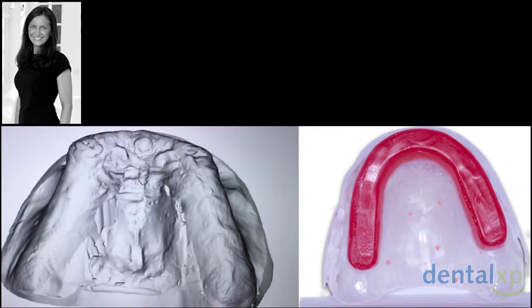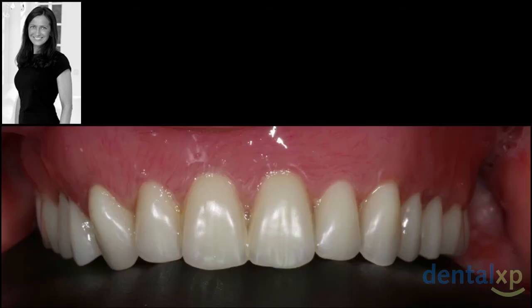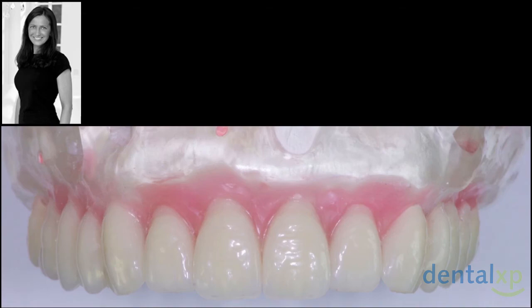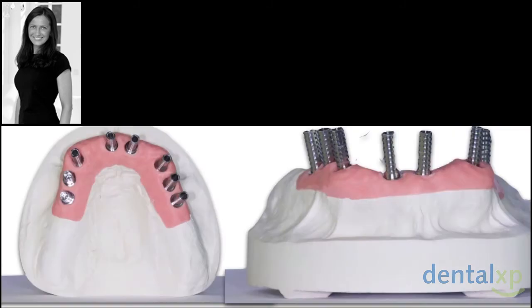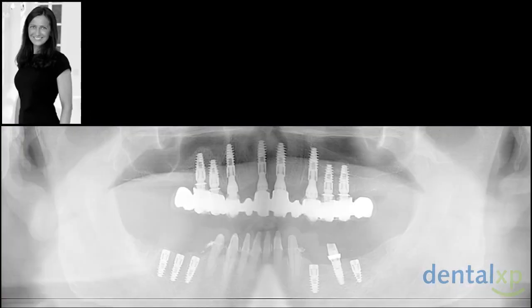Now, we do here also a scanning of the jaw and a smile planning with bigger teeth than he has, because the two prosthesis teeth were too small. And this is the basis for a wax-up and of the planning. Everything goes as we know. Screw-retained abutments, provisional. That is how he goes home.